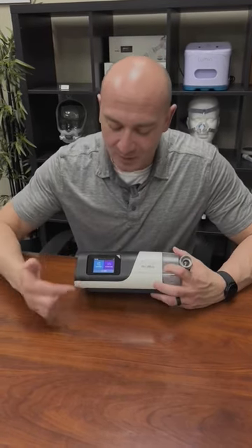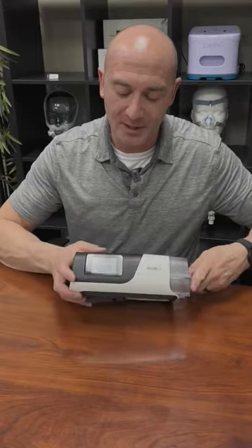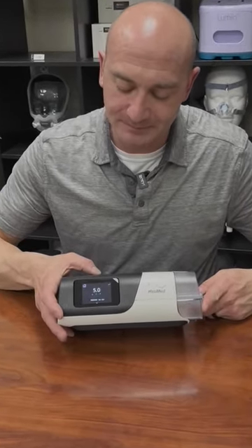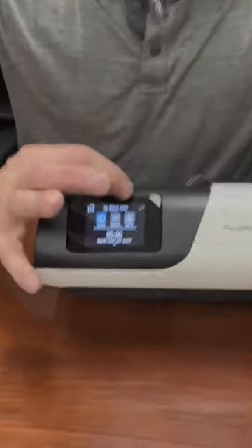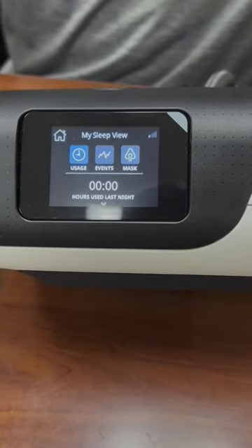So right now, you can see your screen's normal there. If I press the start button, I'm going to cover the hose so it's not quite so loud. Pressure starts up. Now, if I press the stop button, you'll notice in the top left-hand corner, there's a snowflake there. It just means the machine's going through a cooldown.